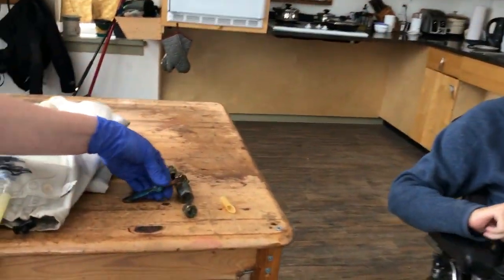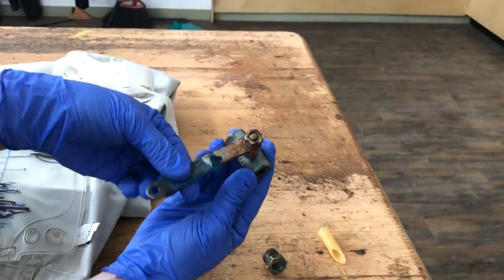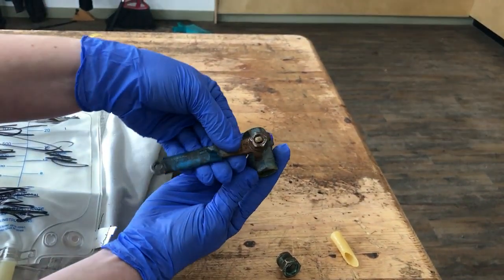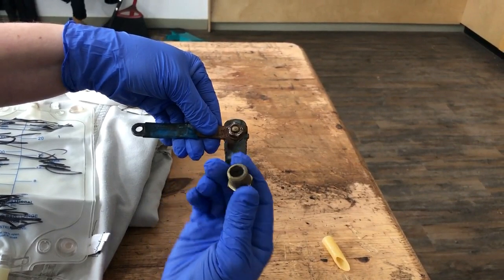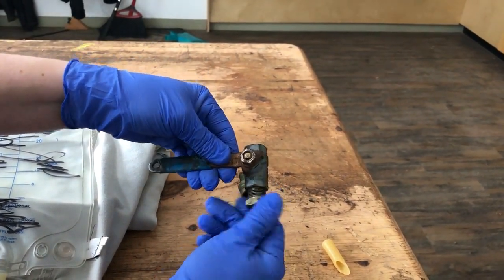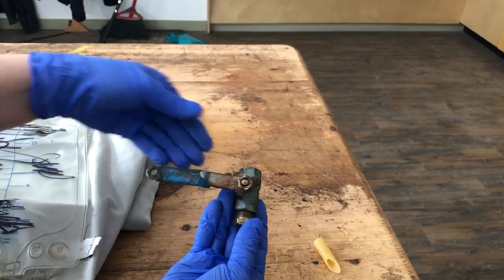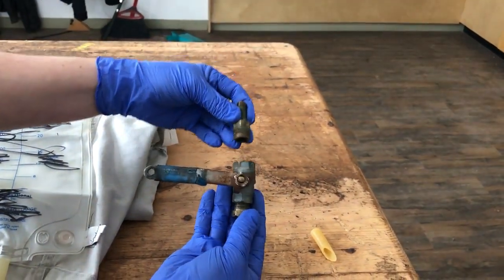So this is the plumbing valve itself. I've straightened out the handle on it, and I've drilled the hole in the very end. And then from the bottom, this is the bottom fitting. It's hollow, and you screw it in to the plumbing valve to attach it to the plate, tighten it down nice and solid. And then on the top, you just screw in this spigot fitting.